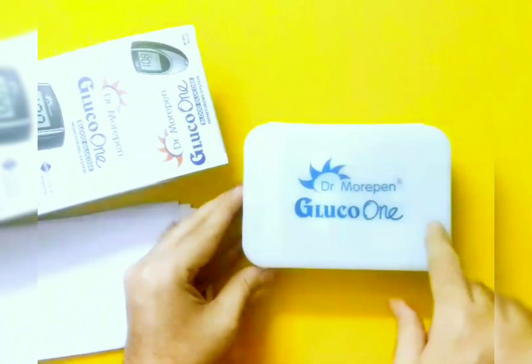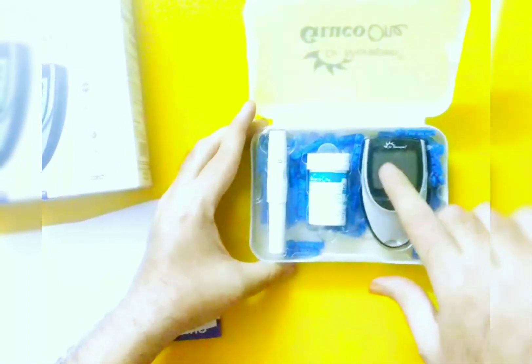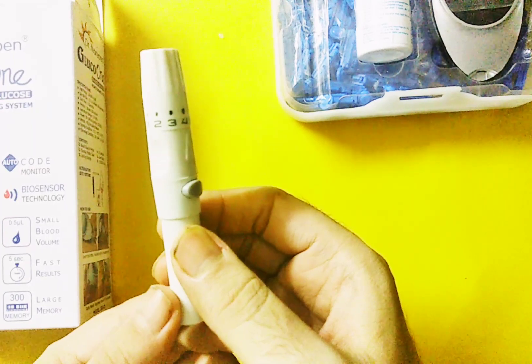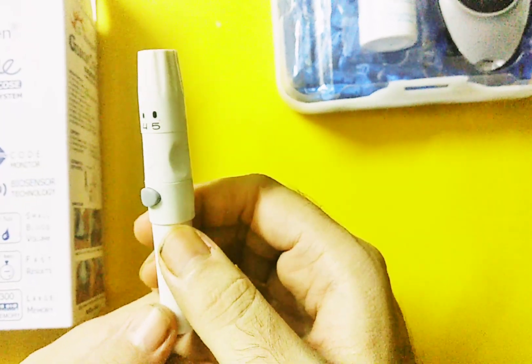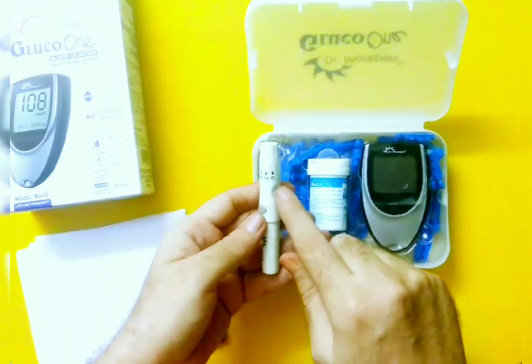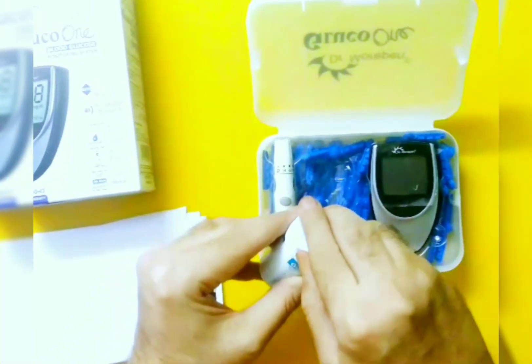So this is what we have — Dr. Morepen Gluco One — which is used for testing. I'll show you what it has. I've bought lancets separately; it comes with only 10 lancets but I bought a few more. This is the lancing device, used to prick the skin. It has five settings, zero to five. People with thin skin should set it at a lower level, and people with slightly thicker skin should put the setting at four or five.